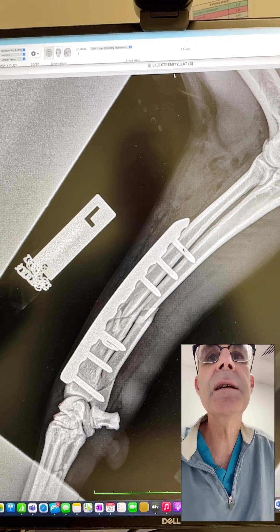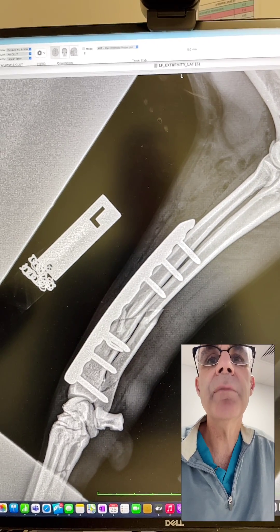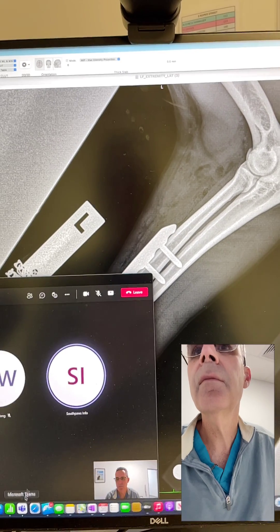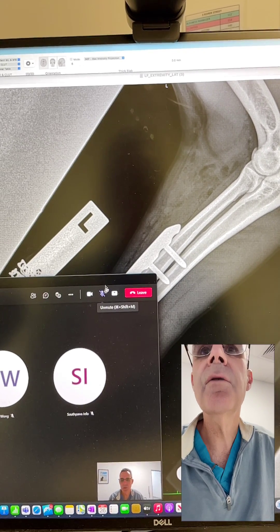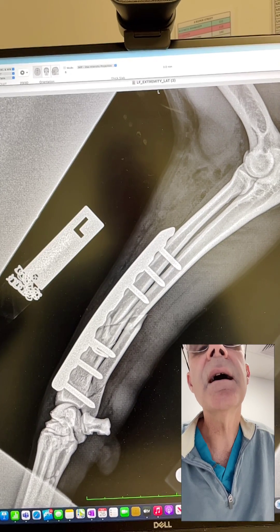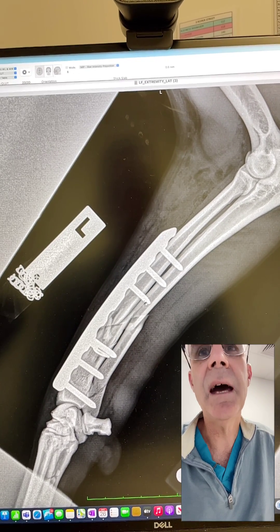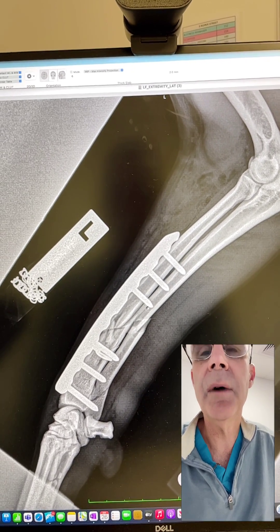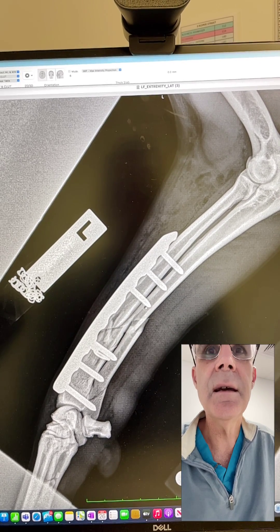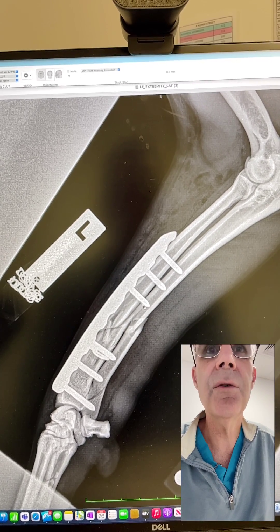If I could critique my repair, my screws are a little bit long — all of them. That's probably just because I added a couple of millimeters to the length, and my depth gauge was already showing that the screws were a little bit long.